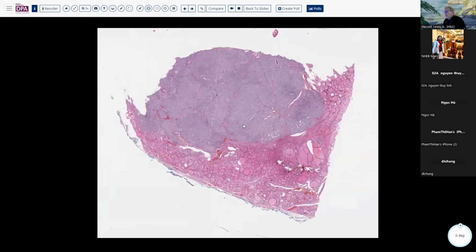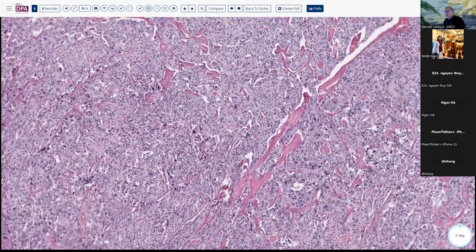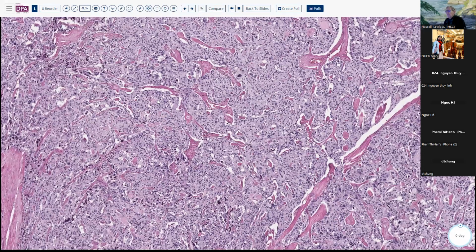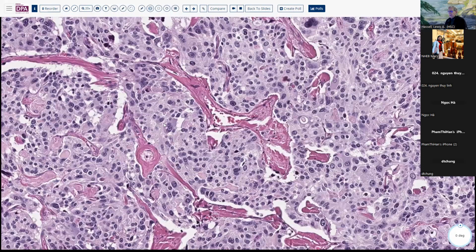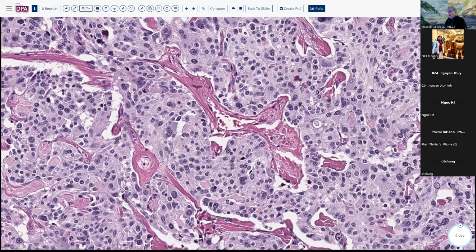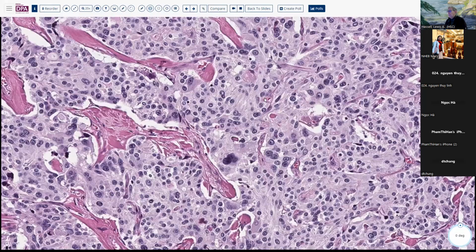Here's the more frequent situation, identifying the neoplasm. And medullary carcinoma in the thyroid is one of these lesions that can be quite variable. Now here's a lesion where we have a fairly cellular tumor, mostly solid growth, fairly pleomorphic and mitotically active cells, slightly grayish cytoplasm. It looks a little bit like a paraganglioma or even like a pheochromocytoma type of lesion just because of this growth pattern.